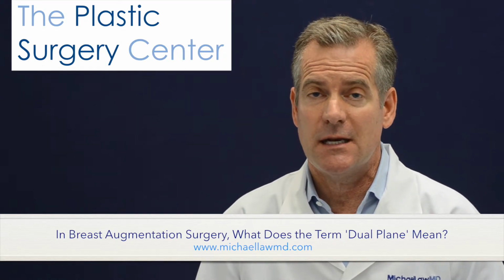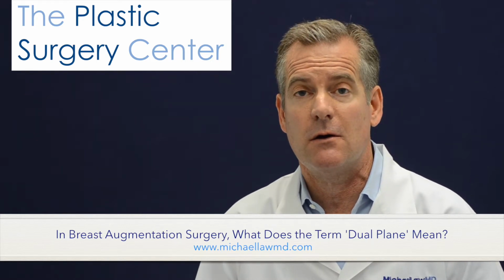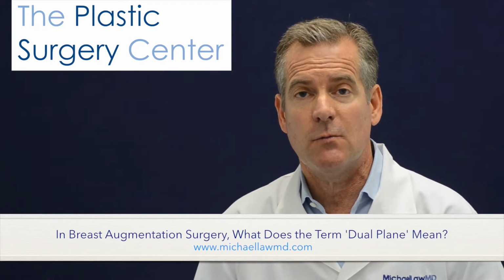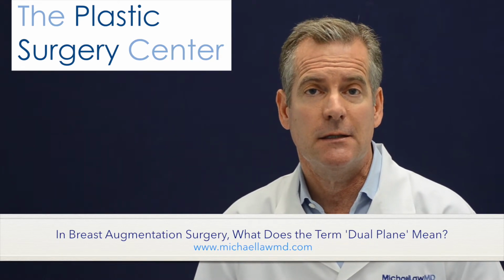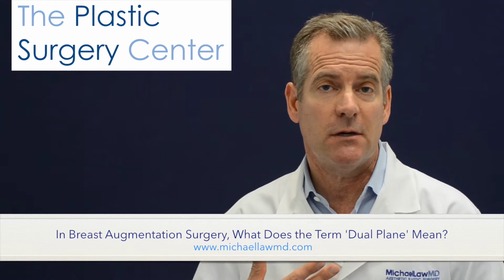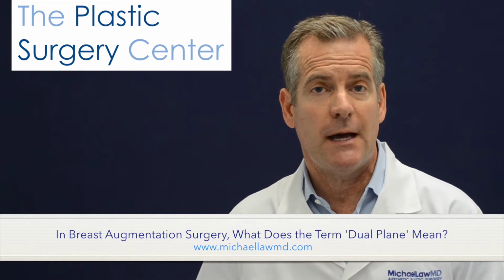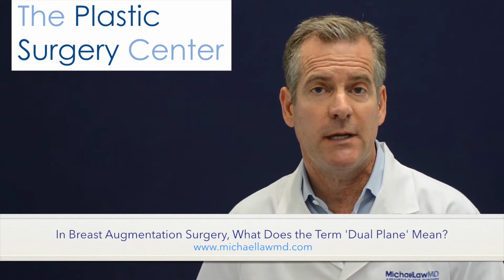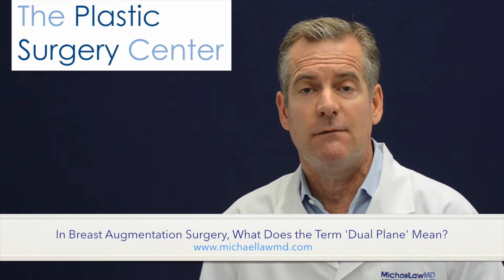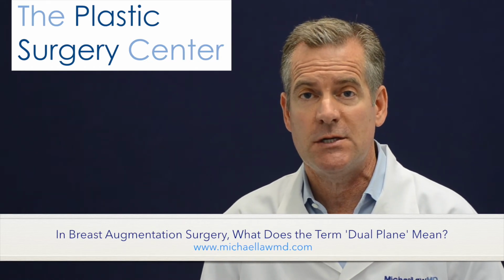This is an unaesthetic outcome and very troubling to patients that have it, so it is to be avoided at all costs. So if you release the pec major muscle, you are creating what is referred to as a dual plane pocket. There will be a portion of the implant in the upper part of the breast, in the cleavage area, where the implant is subpectoral. However, below in the lateral outer quadrant of the breast, the implant will essentially be submammary. There'll be no pec major muscle covering it. If you're having a subpectoral augmentation, you are by definition having a dual plane augmentation.